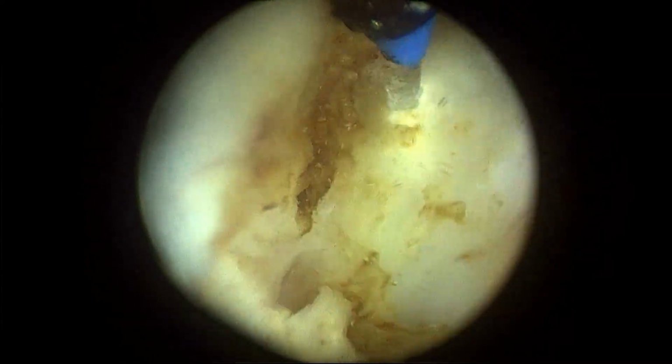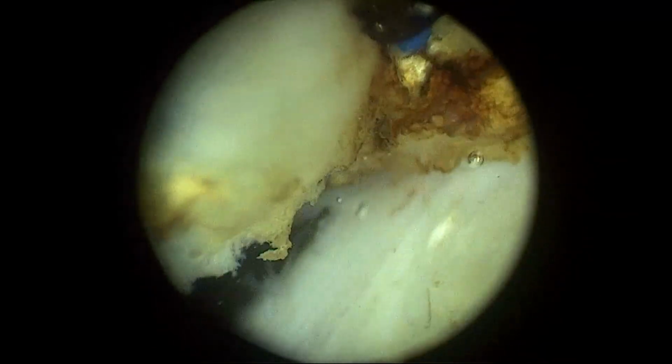I think if you are trying to learn, then 60 gram is good, because sometimes people may feel that they may not even venture into it after seeing it. So it may be discouraging. So ideally a 60 gram should be the choice to show it properly. Is because the prostate is a nodular disease. At places there are multiple nodules where the capsule is thin, where it is difficult to appreciate the capsule properly, and you go a little deeper also, and that also leads to bleeding.